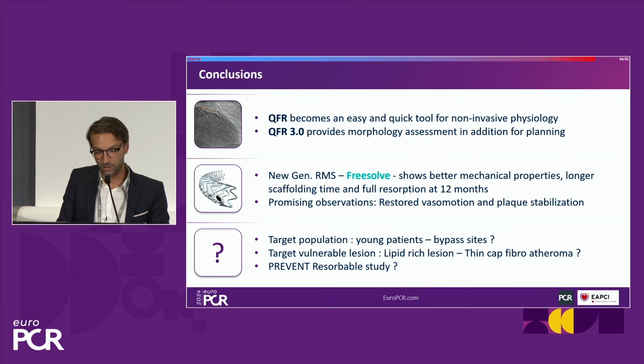So let me conclude that QFR becomes an easy and quick tool for non-invasive physiology, and it can give lesion-based and vessel-based analysis, and it also helps planning the angioplasty with the morphology features of the 3D reconstruction of the vessel. The new generation resorbable magnesium scaffold FreeSolve shows better mechanical properties and longer scaffolding period over time, but still resorption at 12 months.